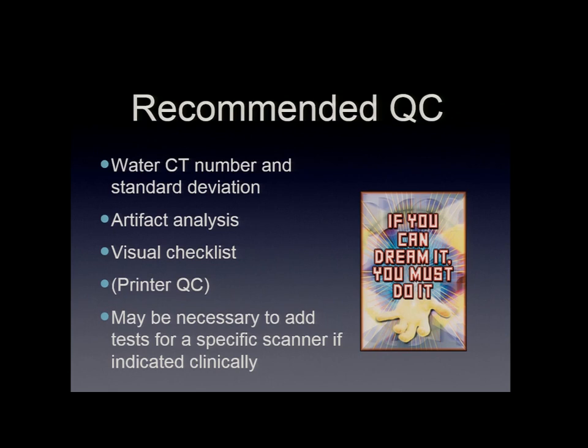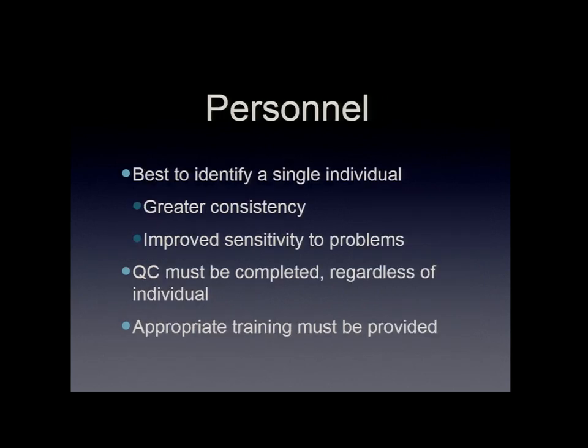The water CT number and standard deviation, artifact evaluation, the visual checklist. You may need to add some additional QC for certain scanners, because if it's got additional applications in the clinic, you might want to evaluate some of these other properties, and so that would be something that is worked out with the imaging team of the radiologist and the QMP and the technologist.